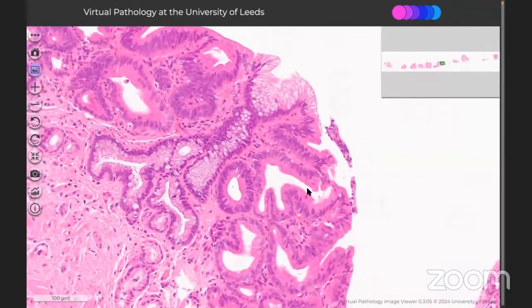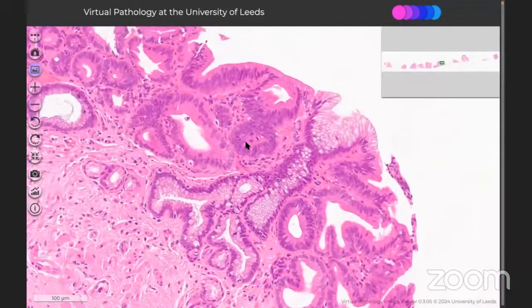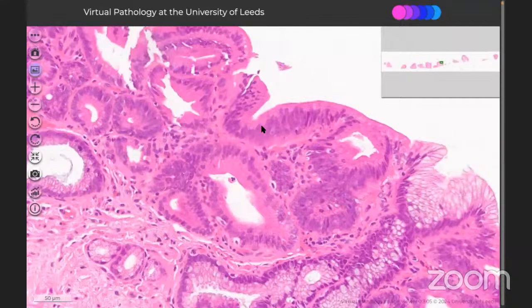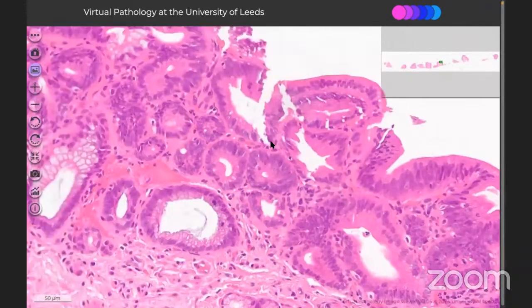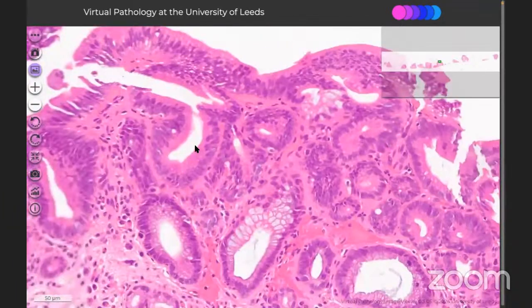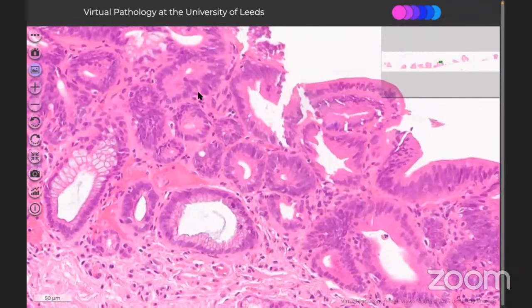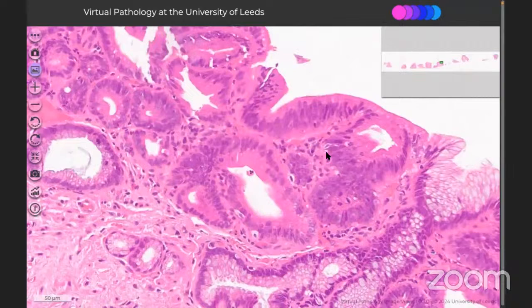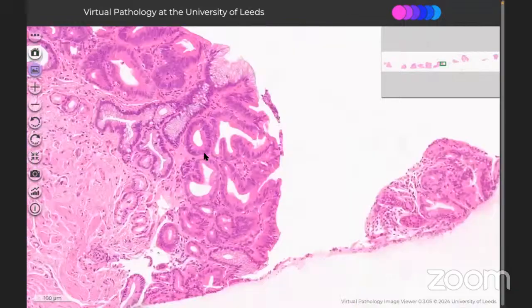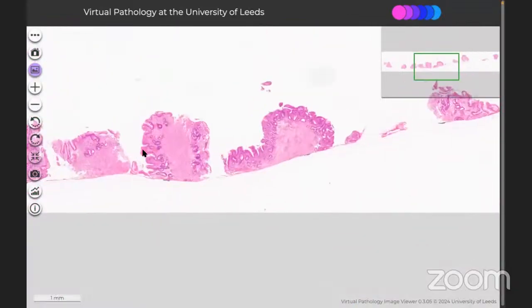And in a few of the glands you can see there is cellular crowding, there is stratification, there is mitosis. The nuclei are pencillate, even though it is not reaching up to the upper half of the cell thickness. So there is definite cellular crowding, increased mitosis, hyperchromasia, and loss of cellular mucin. So all these are pointing towards a dysplastic process.